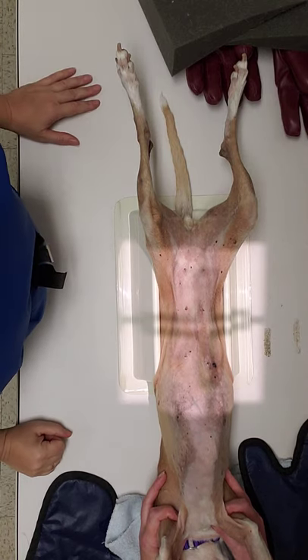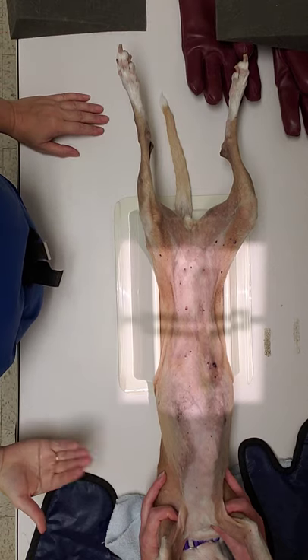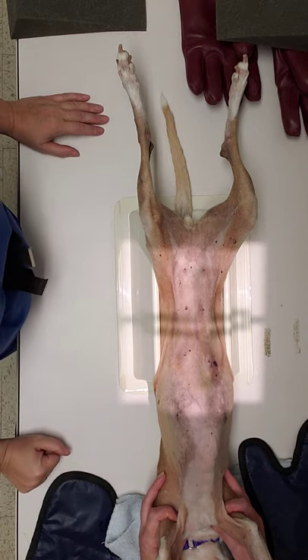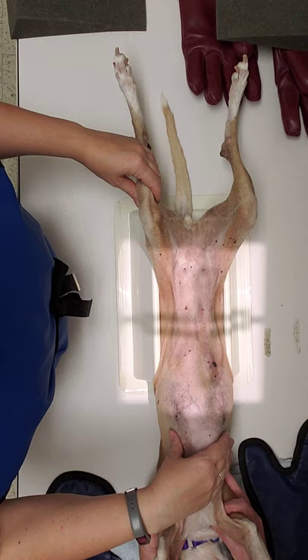We're going to discuss how to position and collimate our patient for our VD abdomen. DV abdomens are going to be very similar — they're just in sternal recumbency and not dorsal recumbency, but you have the same landmarks. So for your VD abdomen, you're going to place them in dorsal recumbency.